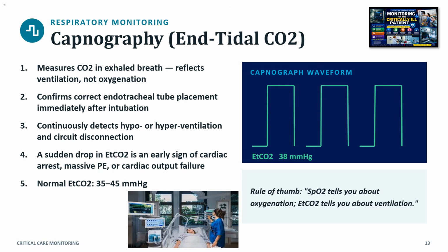Respiratory monitoring. Capnography. End-tidal CO2. 1. Measures CO2 in exhaled breath. Reflects ventilation, not oxygenation. This shows how effectively CO2 is being cleared from the lungs. 2. Confirms correct endotracheal tube placement immediately after intubation. This provides immediate verification that the tube is in the airway and not in the esophagus.